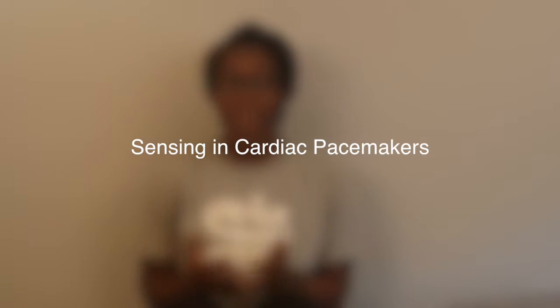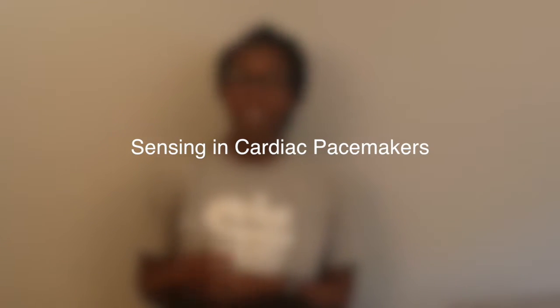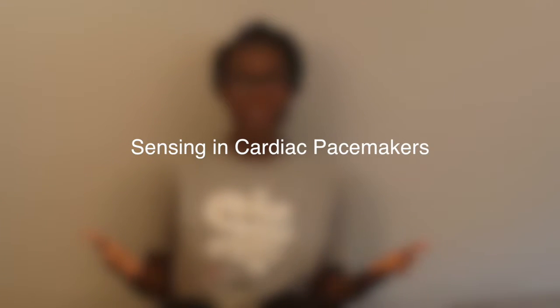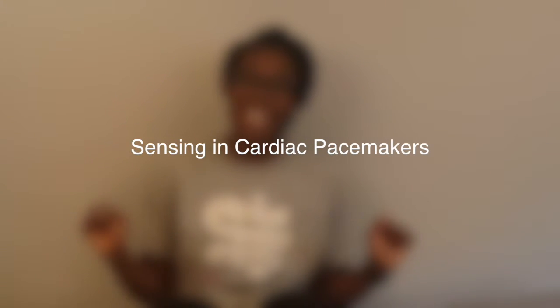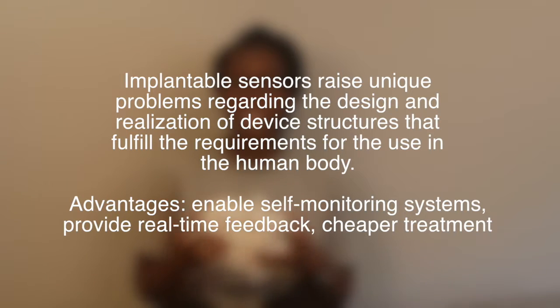So, as I said, today we're going to be talking about implantable sensors, and these include pacemakers, electrodes, as well as even mechanical sensors. Now, pacemakers are used for basically monitoring or resetting a heartbeat. And one of the most vital application areas of the molecular sensors is basically the measurement of activity in the specific human body. And among such tools for biomedical sensing applications, implantable sensors raise a unique problem regarding the design and realization of device structure that fulfills the requirements for use in the human body.